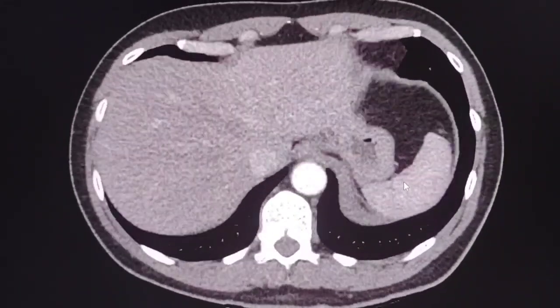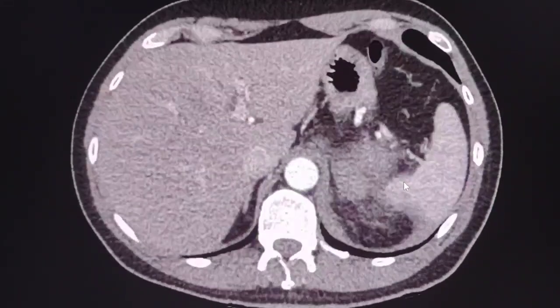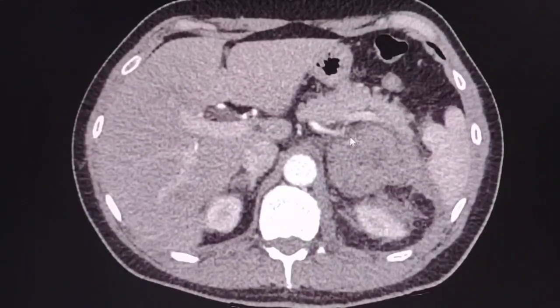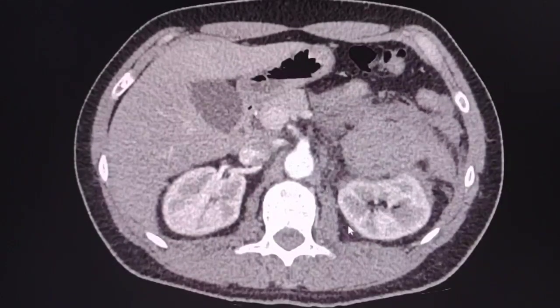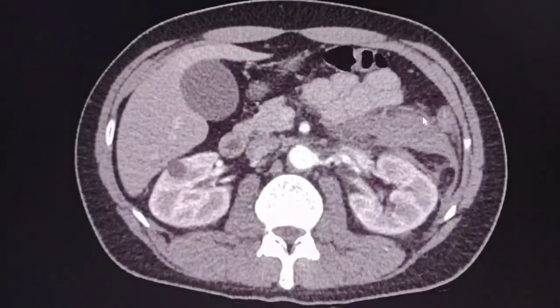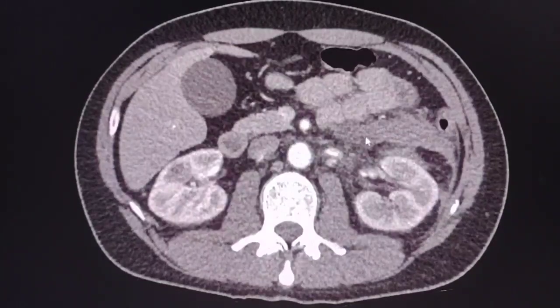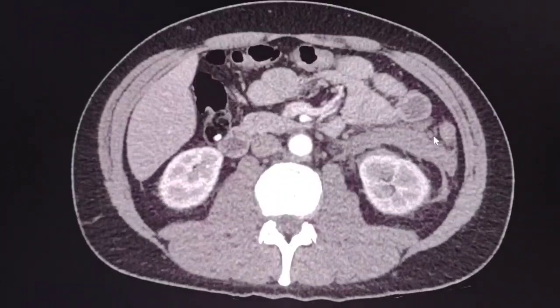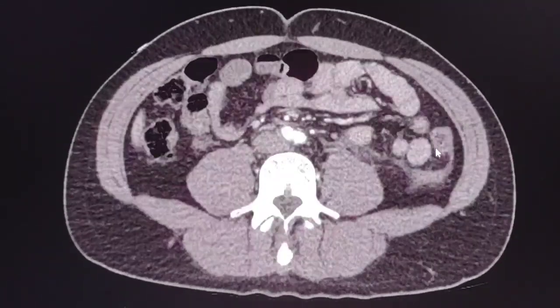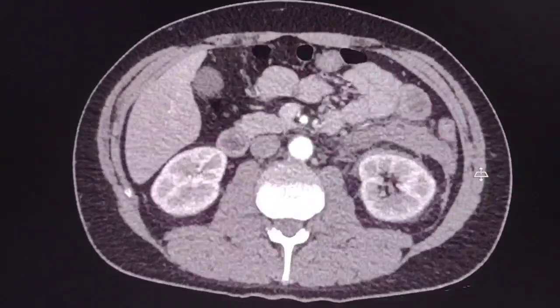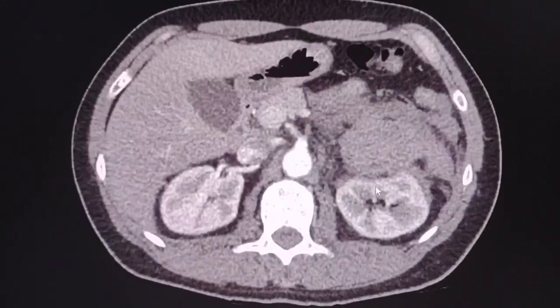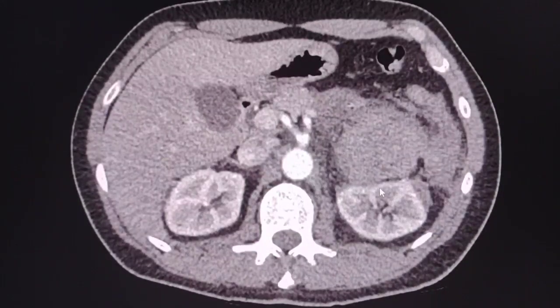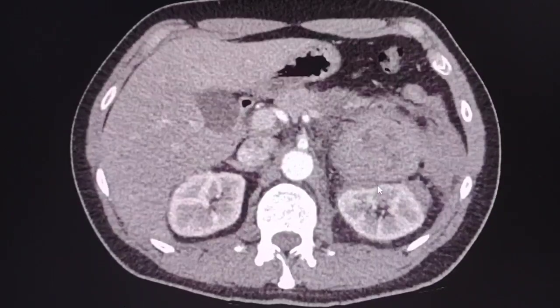Let's scroll the images up and down and make your impression. As you can see, here is a mass, here is the left kidney, and here is the hematoma. Let's go up again and have a look. The mass is in contact with the anterior aspect of the left kidney but does not appear to arise from it.